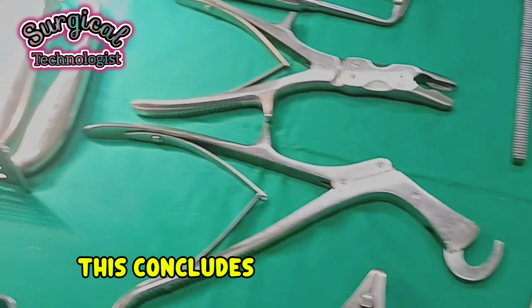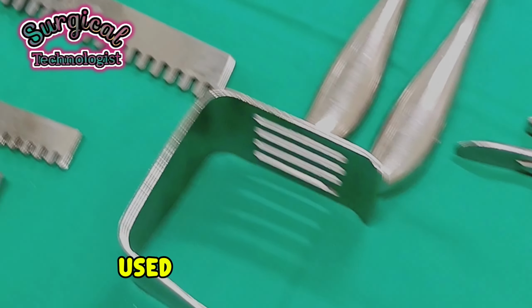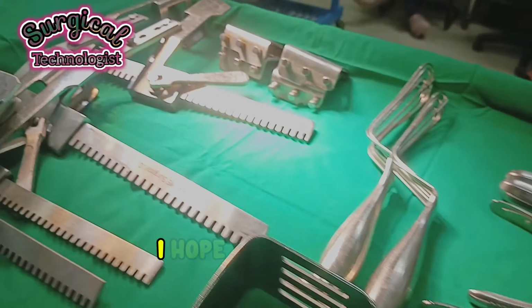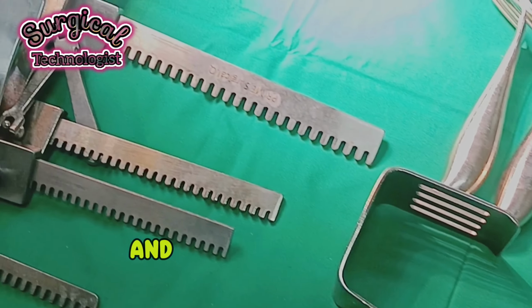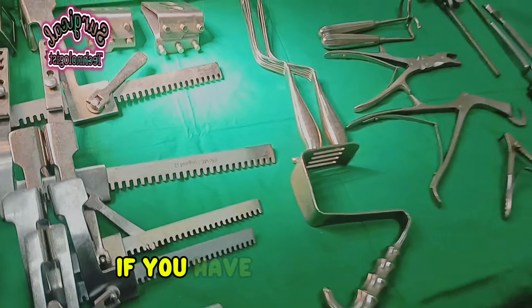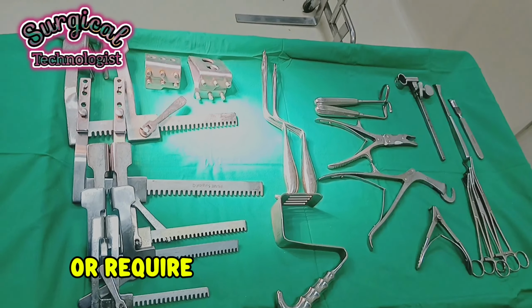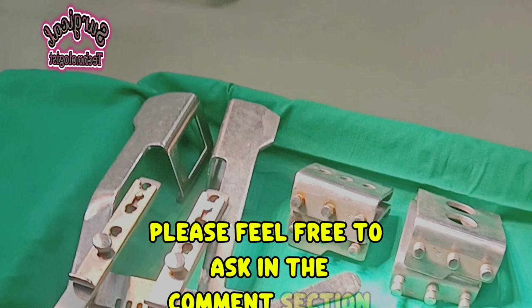This concludes today's lecture on basic instruments used in thoracic surgery. I hope this session has been informative and has enhanced your understanding of the topic. If you have any questions or require further clarification, please feel free to ask in the comment section.